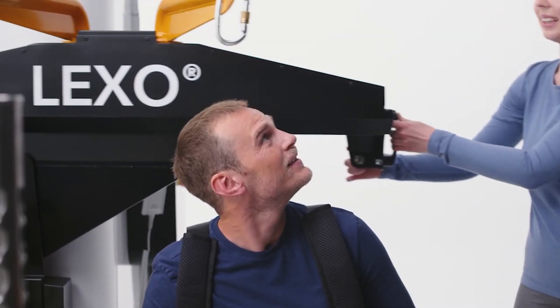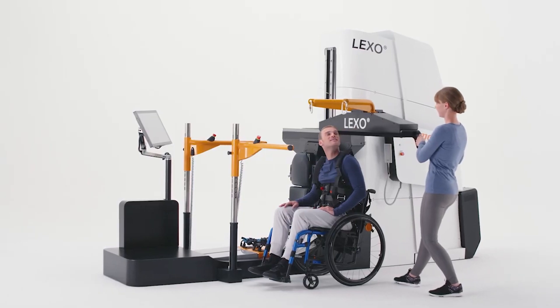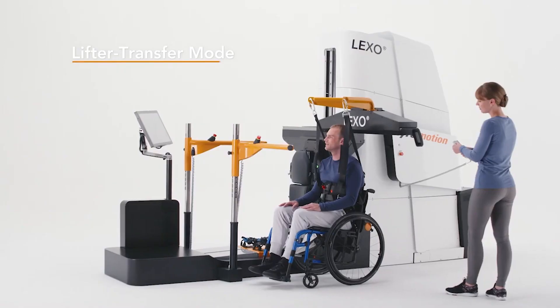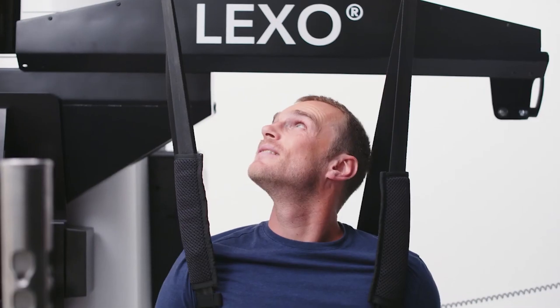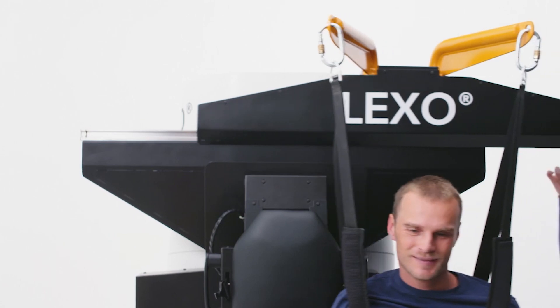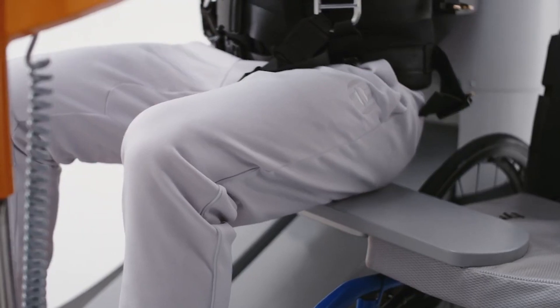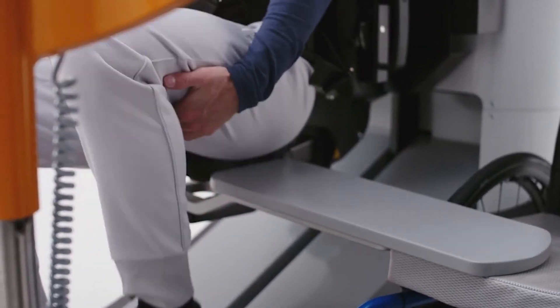Lexo offers different transfer options specifically catered to the severity of the patient's condition and their existing functionality. The lifter transfer enables the therapist to raise and position the patient effortlessly, whereas the self-transfer mode offers mildly impaired patients the possibility to slide into position independently.